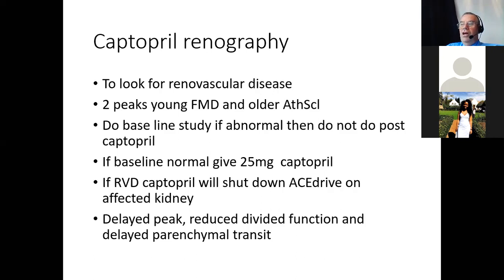So to drive getting more blood, it increases blood pressure by changing the amount of aldosterone produced, and this comes through activating the ACE system. And if that is blocked by an ACE inhibitor, then they can't drive more blood into the kidney, so the renogram shows a drop in function of that kidney.